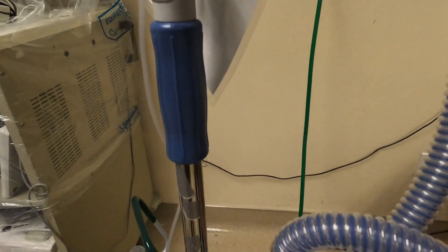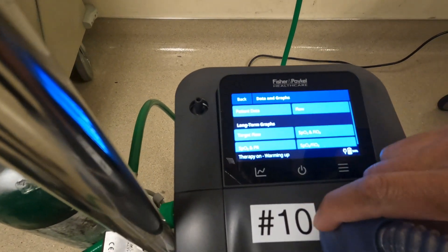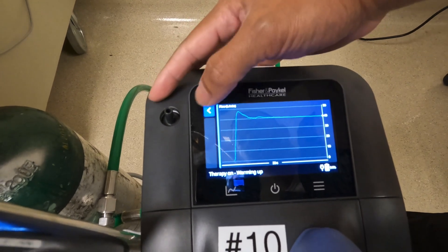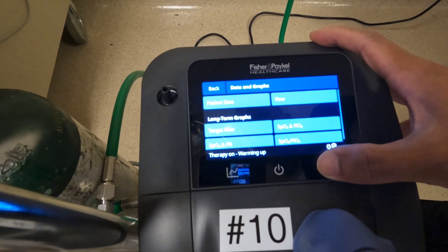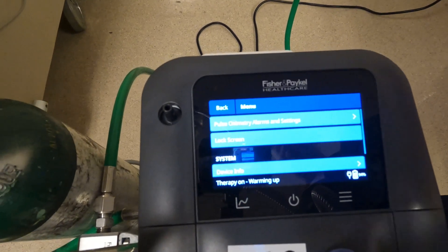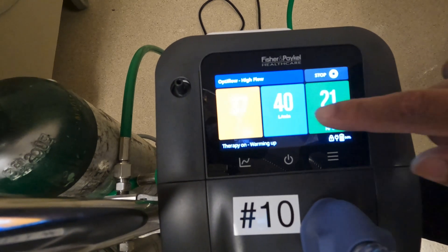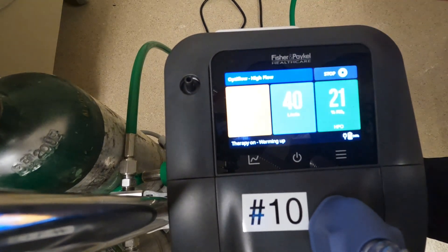Some other settings on the main touch screen: on the very left, we have data and graphs, which gives you information about the patient and some of the data such as how fast they're pulling. On the right is your menu option — these three bars. Here you can also set settings and alarms, but we don't do that here. We do have the option to lock the screen. To do that, you select lock screen and the device will automatically lock. To unlock, you tap the screen and hold the lock button. Now unlocked.